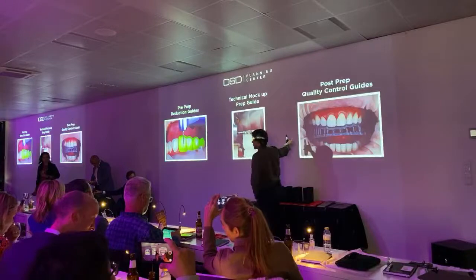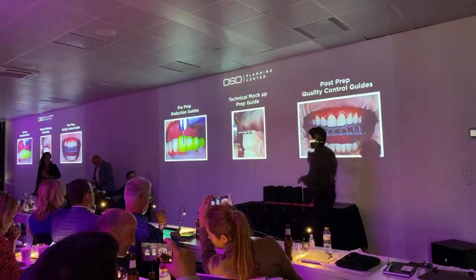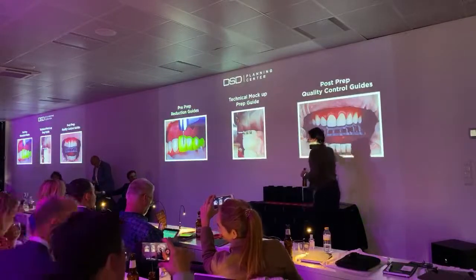You have the main reductions. Then you need to do quality control. Quality control is done with 3 guides. So you have 3 moments, and moment 3 is divided into 3 other moments.